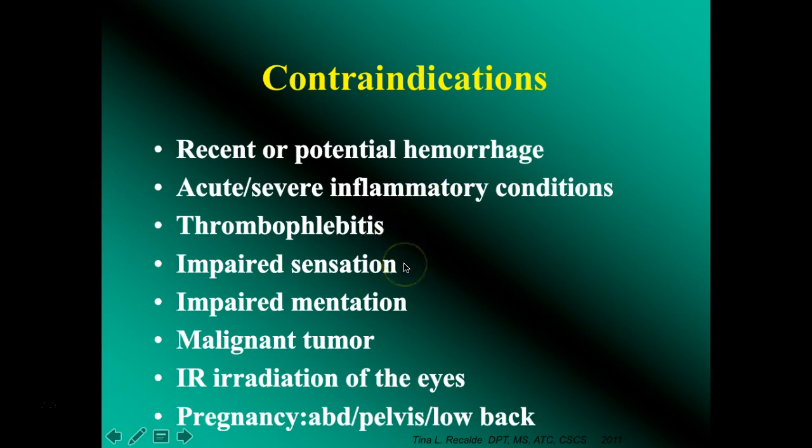Probably one of the number one reasons people get sued and burned is putting it on an elderly person who might have decreased sensation, or a post-op patient that hasn't gotten their sensation all the way back from the surgery. Impaired mentation, where they can't tell you it's too hot. They could just say that feels great and it could be burning them. Malignant tumor, again, we don't want to be feeding that tumor. Irradiation of the eyes, and pregnancy of the abdomen, the pelvis, and the low back. We don't want to increase blood flow to those areas on a pregnant woman.